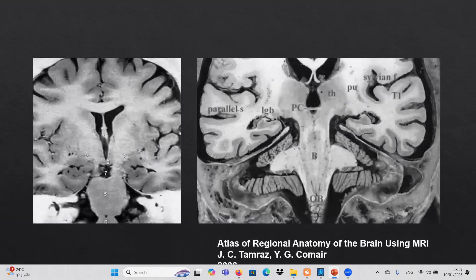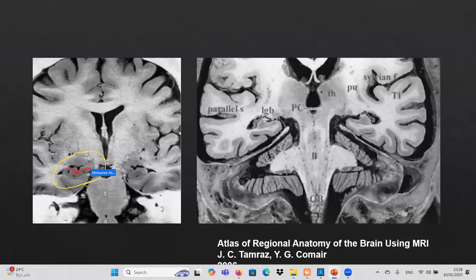Let us briefly review the proper anatomy of the temporal lobe. The head of the hippocampus is serrated in outline, undulated, and interdigitating — with finger-like projections. This is very characteristic for the hippocampal head.